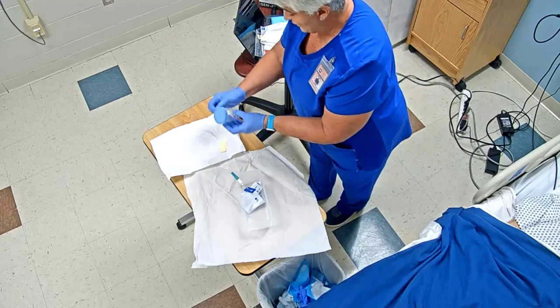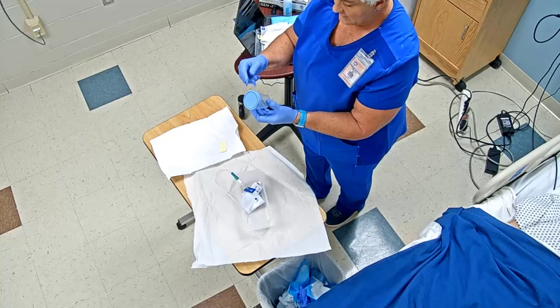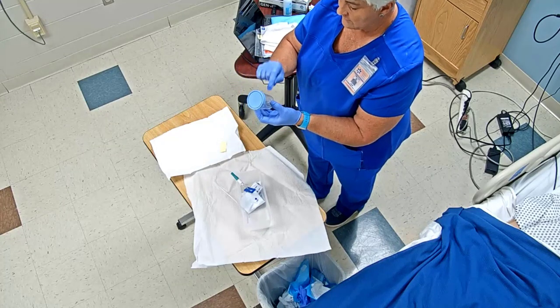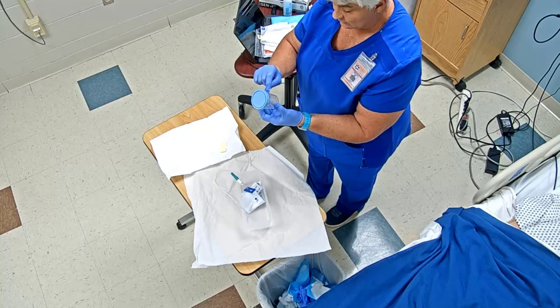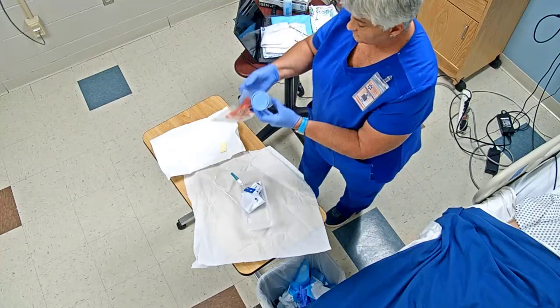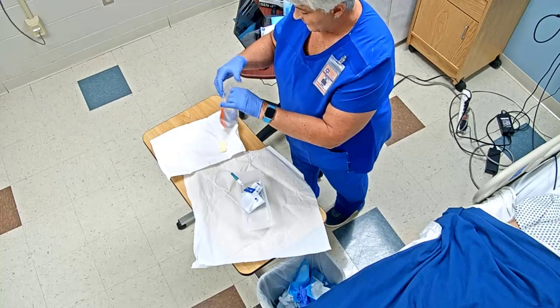And we're going to put our label on there. Now on the label, it will already have the patient's two patient identifiers. It will have the order as to what we're needing for the requisition, but I need to put the date and the time and my initials, okay? So once I do that, then I'm going to go ahead and put it in my biohazardous bag, okay?